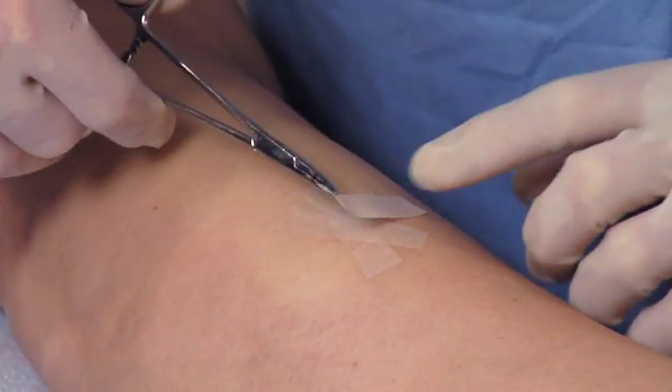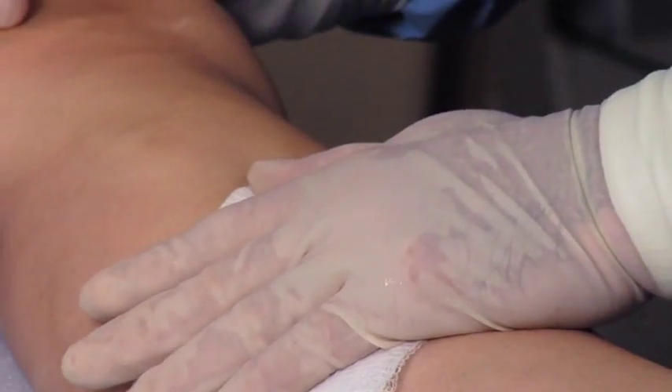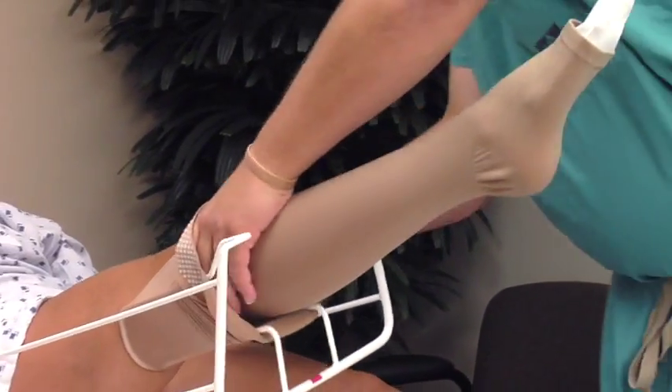Once the ablation procedure is finished, a steristrip tape is placed over the entrance incision and a prescription strength compression stocking is placed on the leg. You are then released to go home.